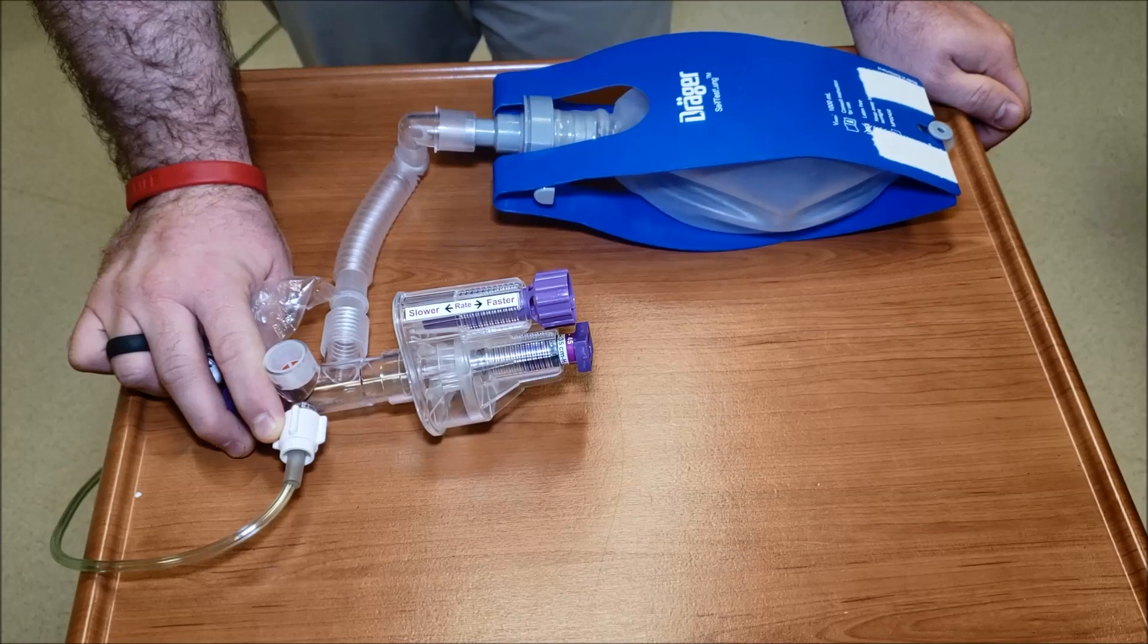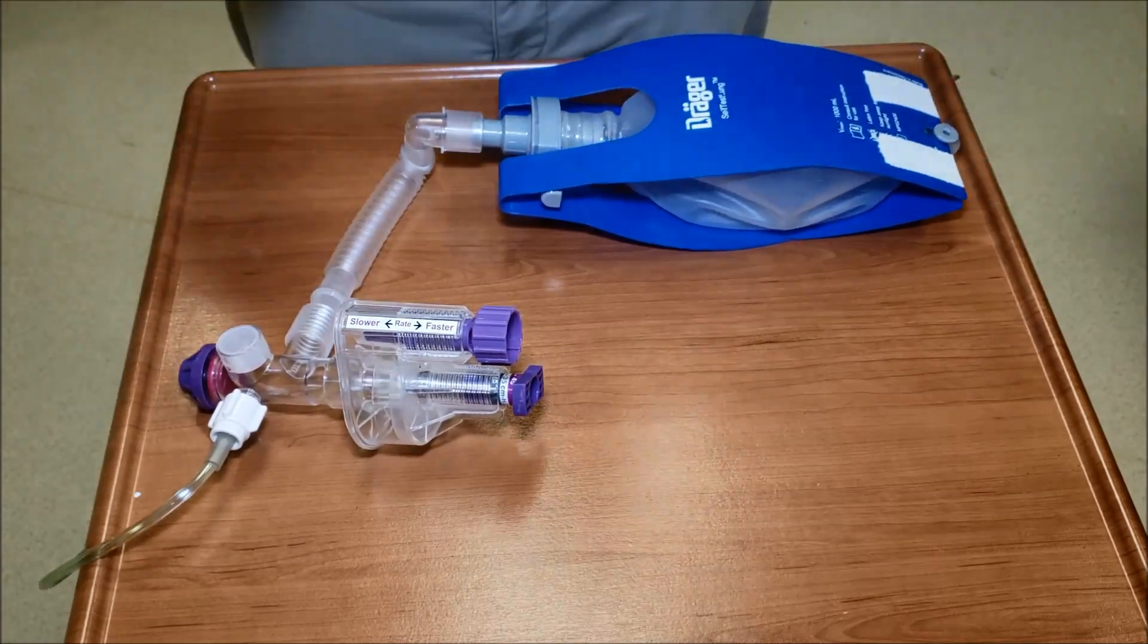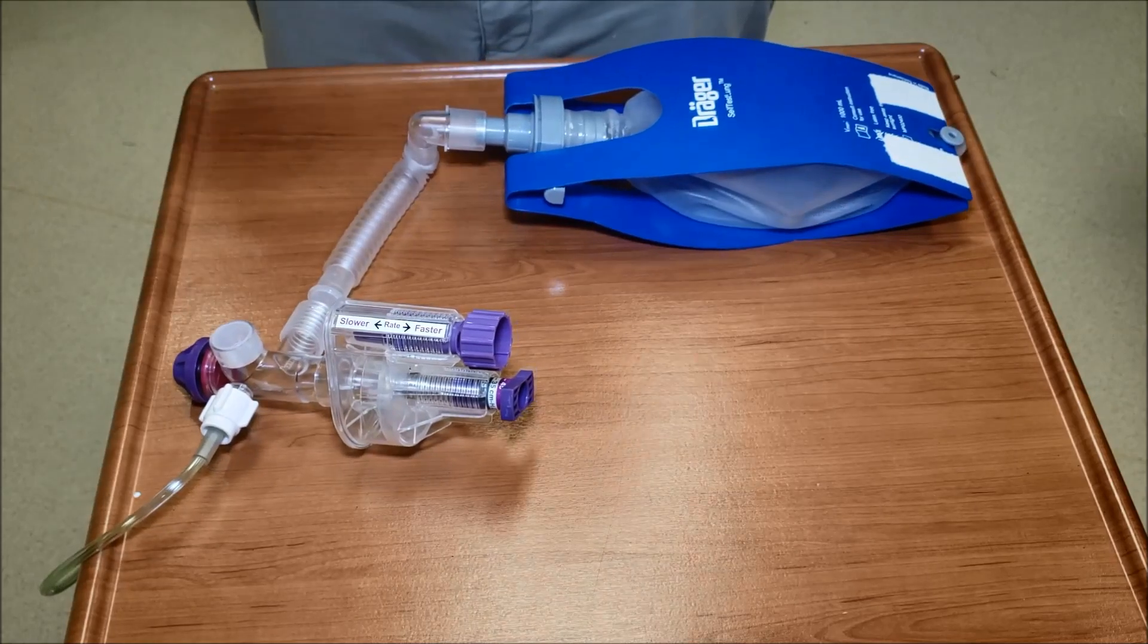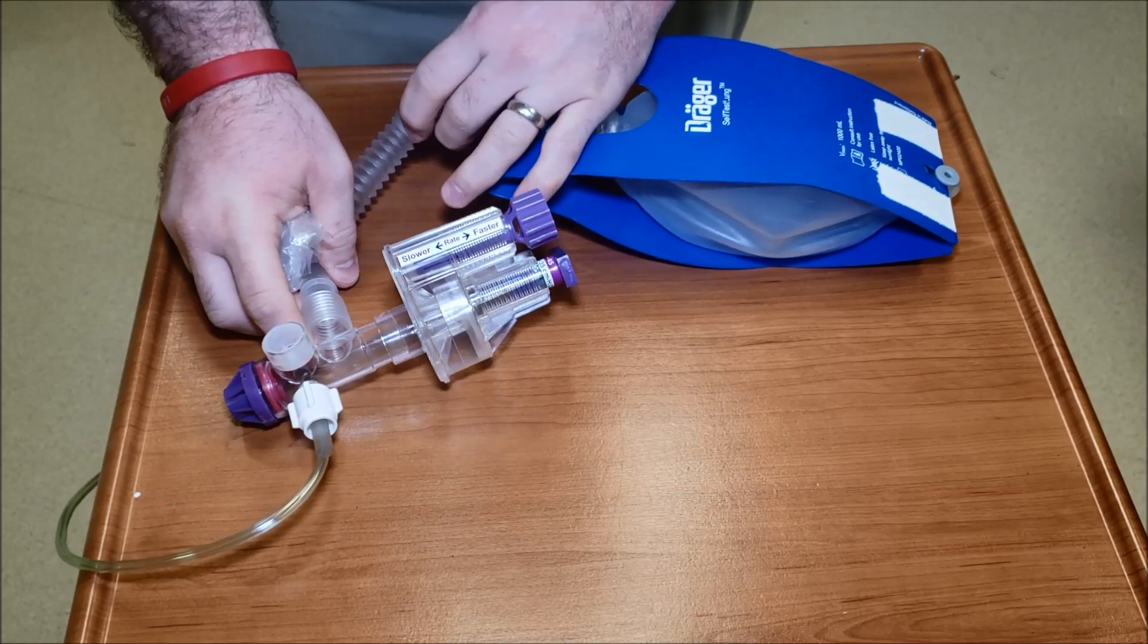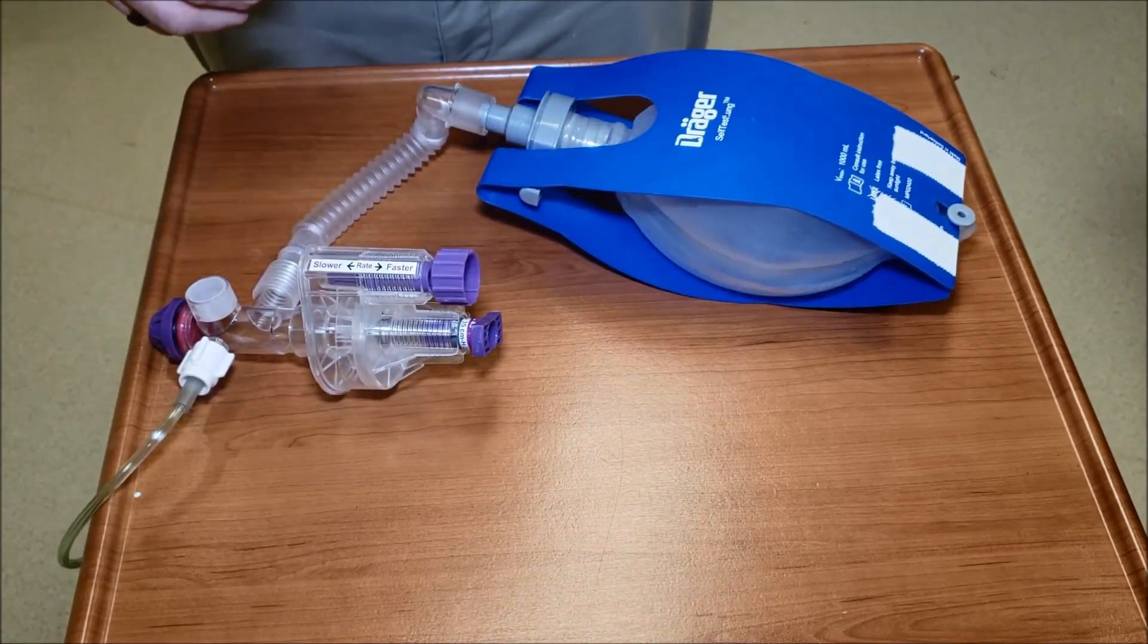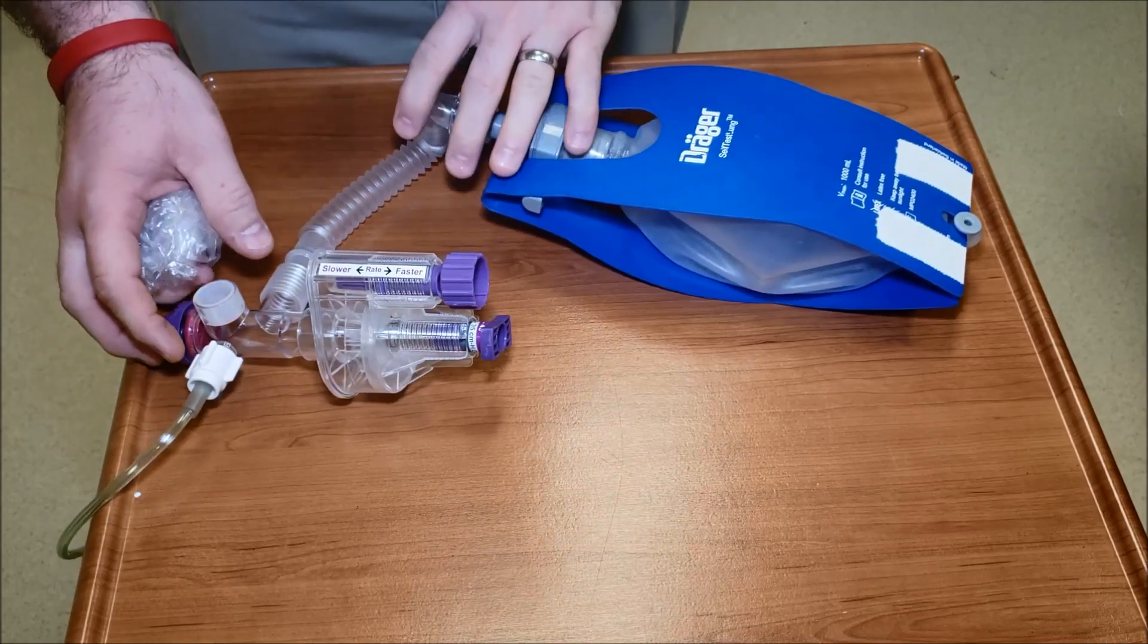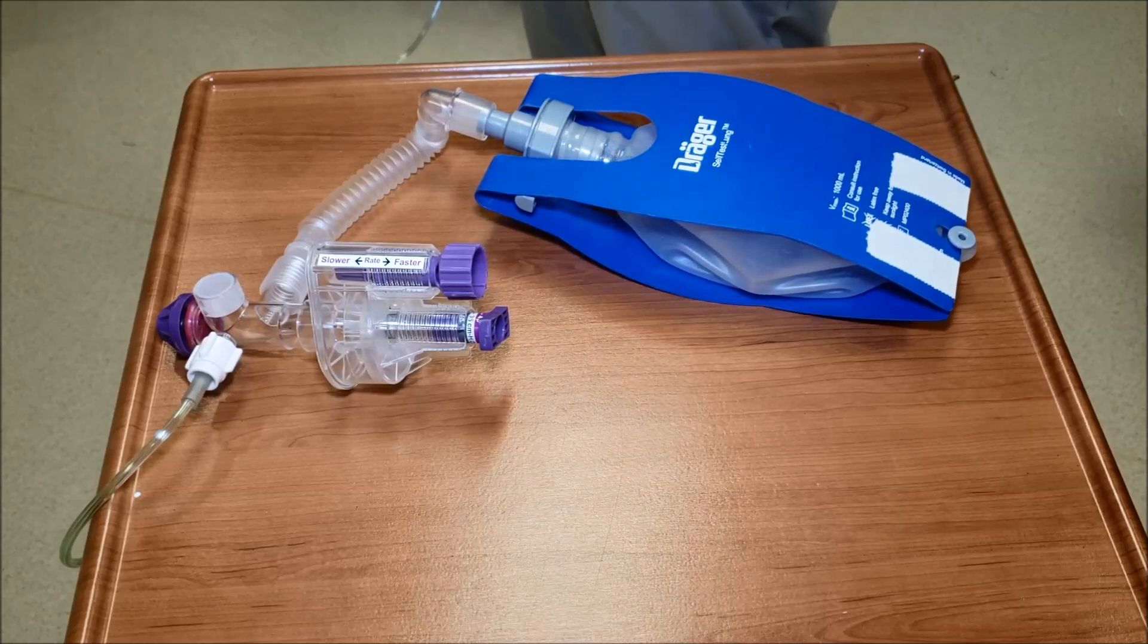The problem right now is that our flow coming in is really low because I don't have the flow meter cranked up back there. So this would be a great, very similar like an IMV rate, a breath every six seconds, ten breaths per minute.